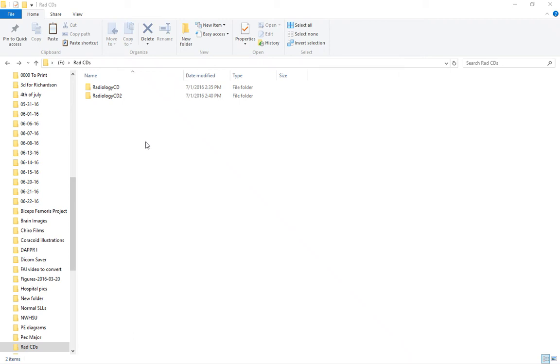I wanted to show how we can find DICOM files on radiology CDs when we want to upload them for a second opinion. I have two different radiology CDs here.